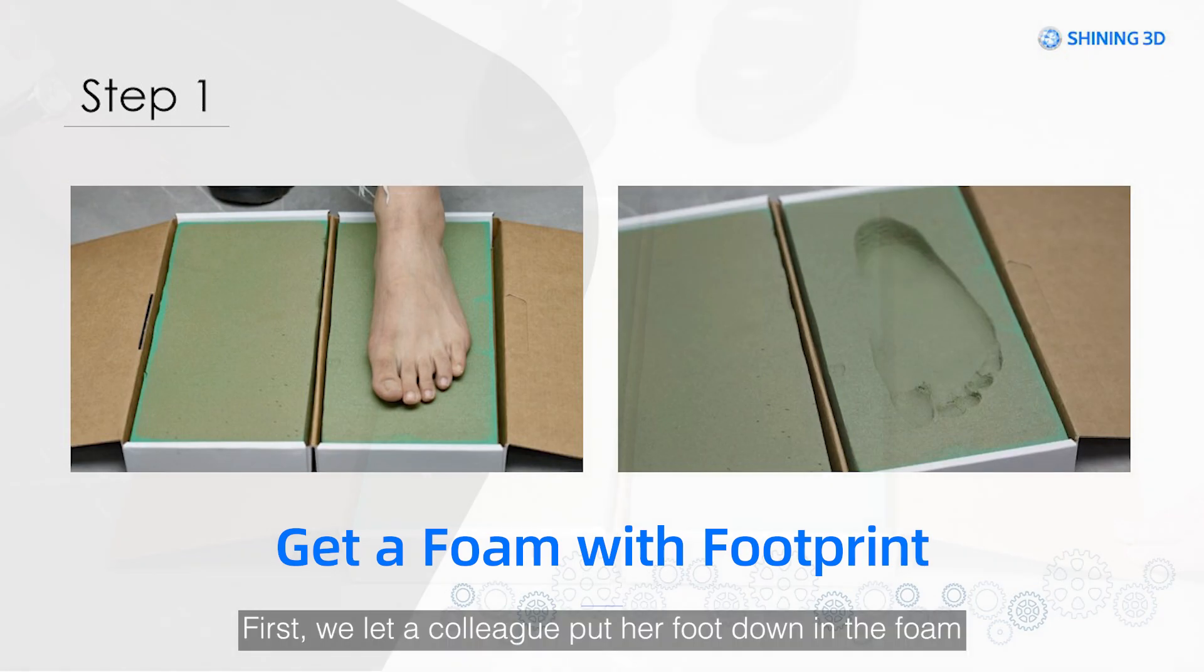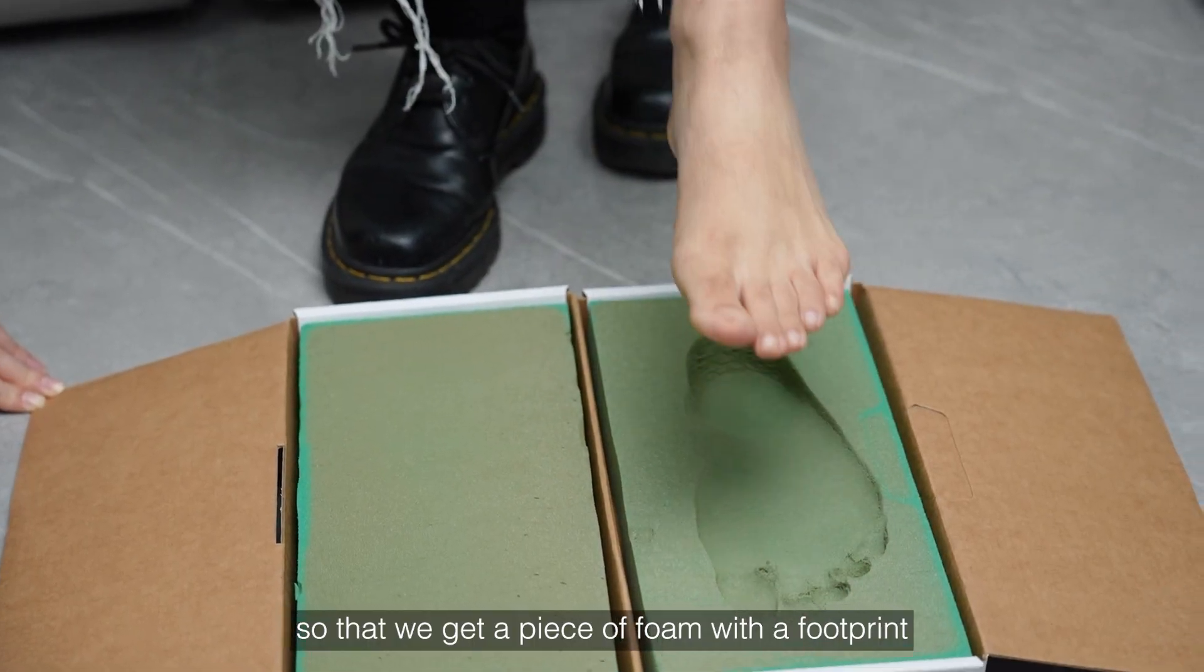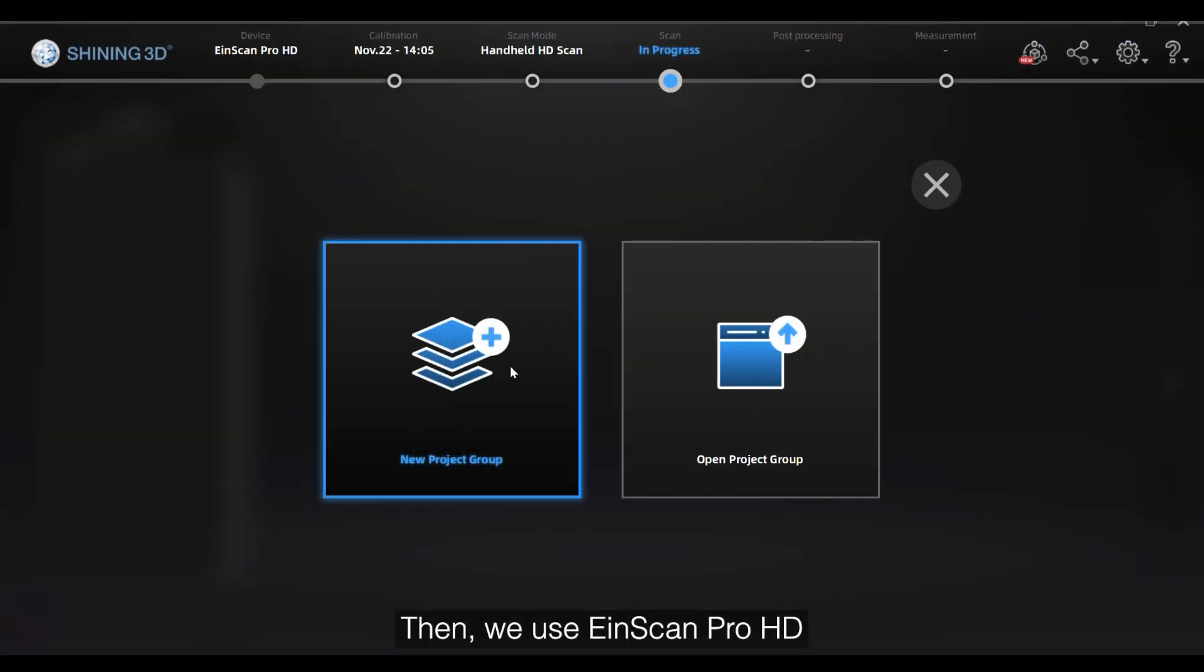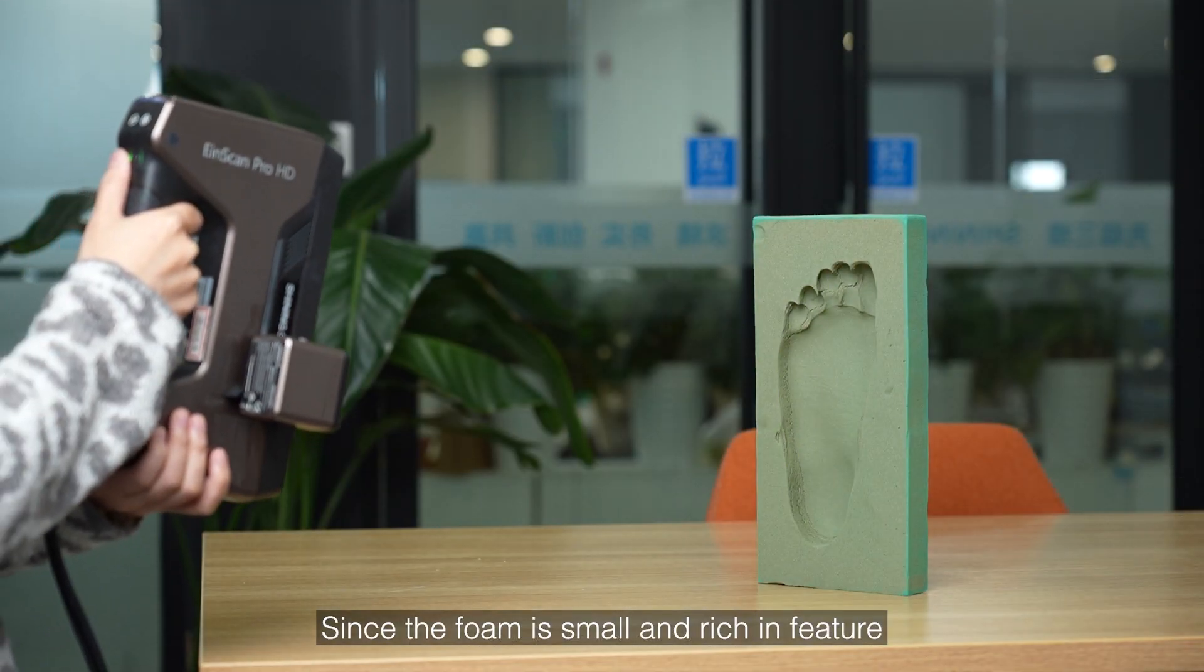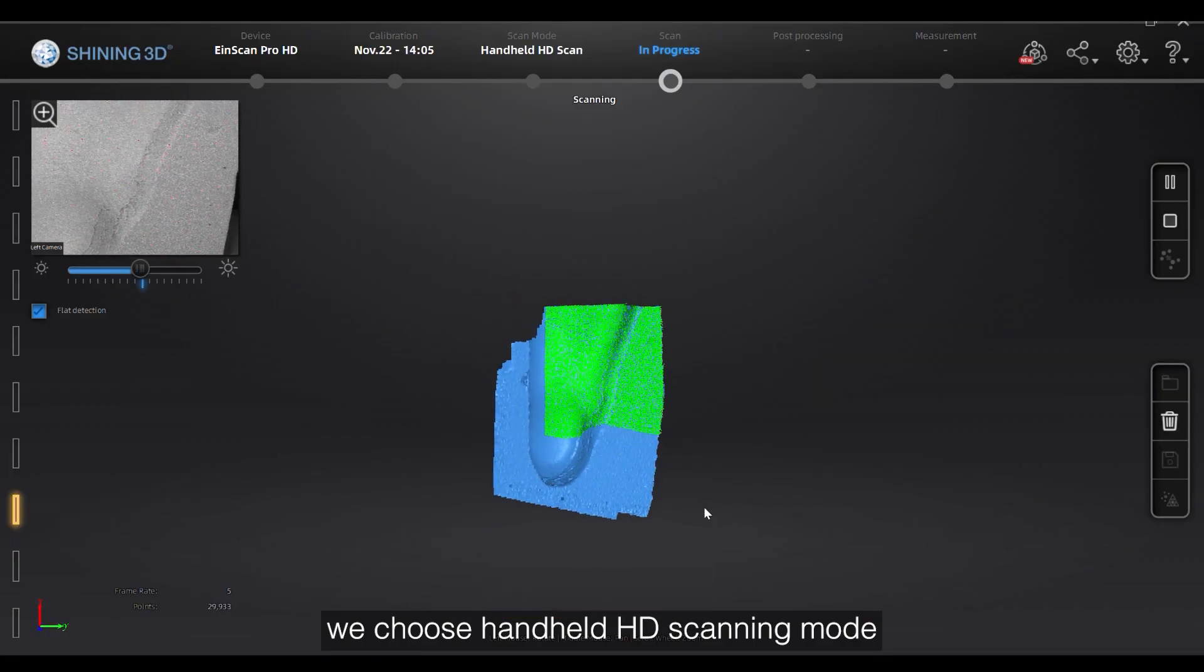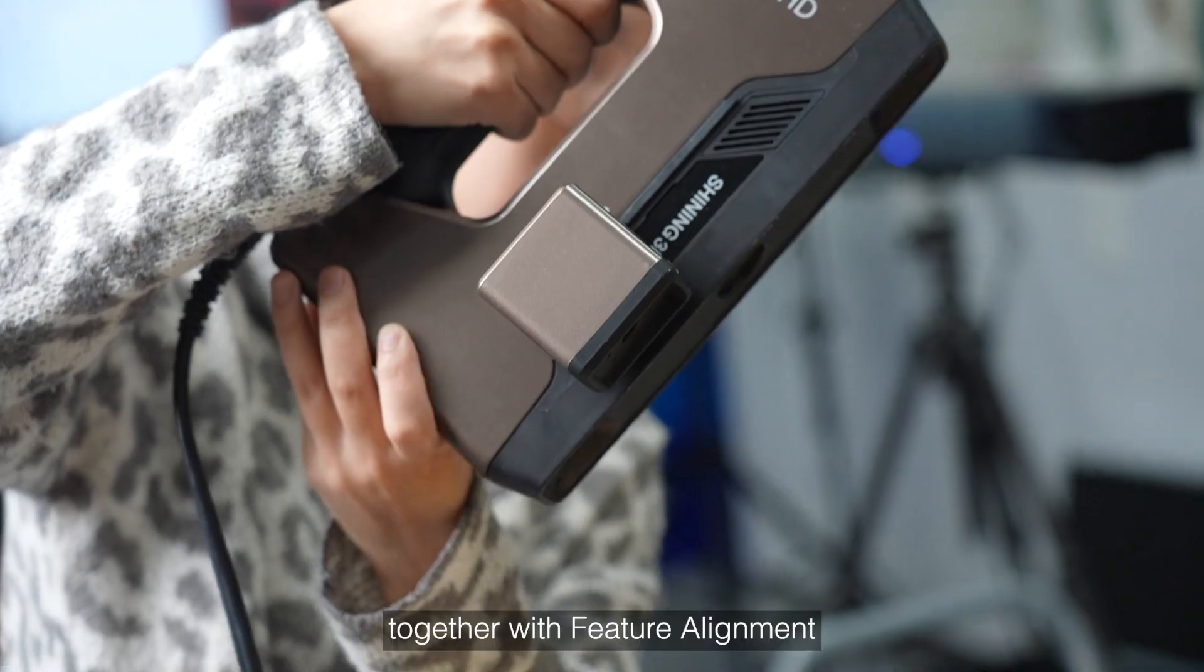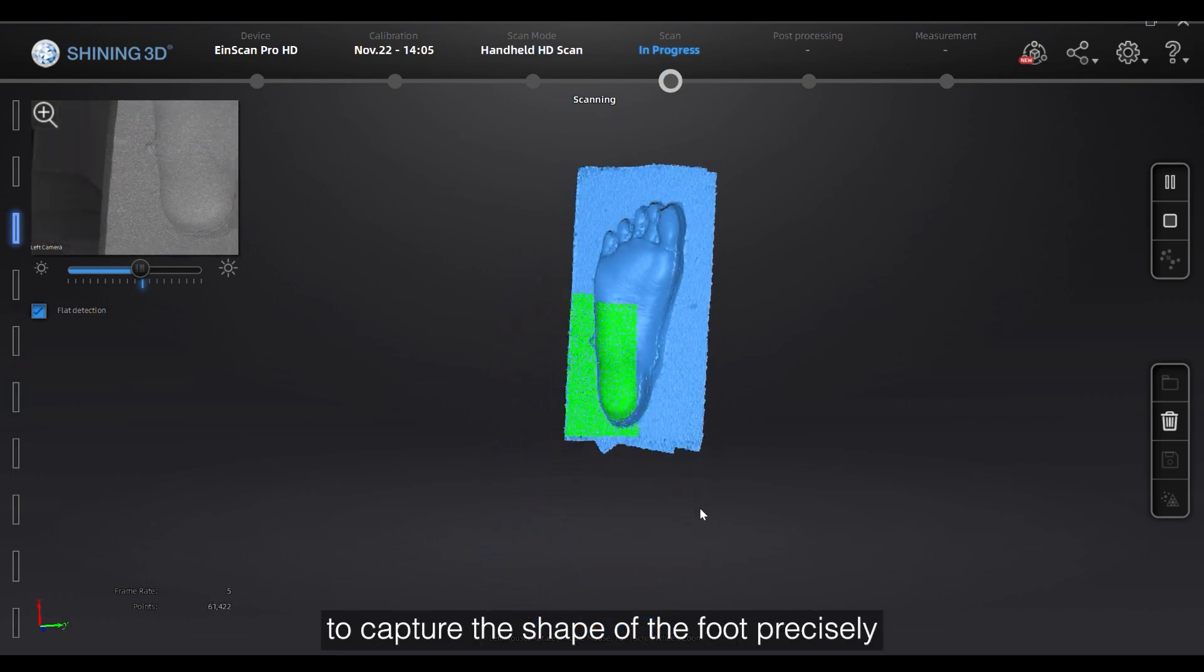First, we let a colleague put her foot down in the foam, so that we get a piece of foam with a footprint. Then, we use EinScan Pro HD to scan the foam to obtain the footprint data. Since the foam is small and rich in feature, we choose handheld HD scanning mode with an accuracy of 0.045 mm, together with feature alignment, to capture the shape of the foot precisely.